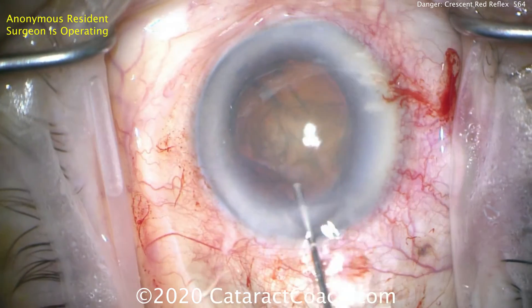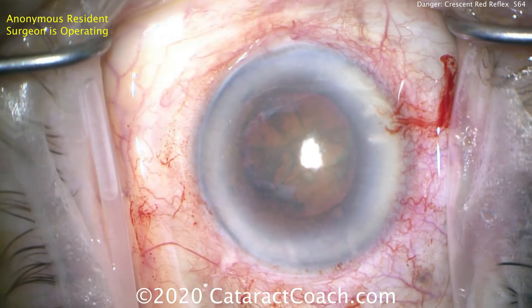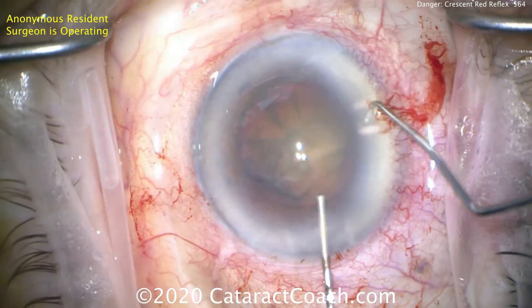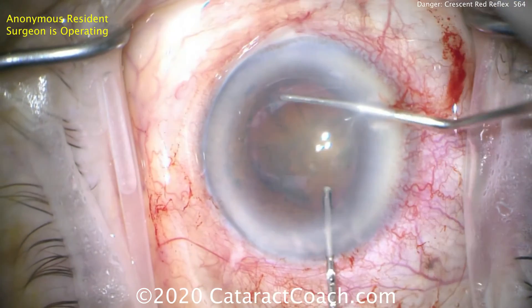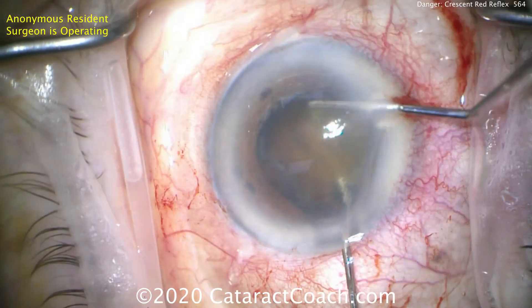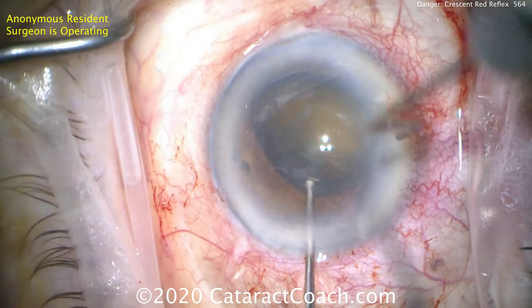Here's where we're going to be surprised. A little hydrodissection — let's try to get the nucleus out of the bag. By getting the nucleus out of the bag, we'll hopefully put less stress on it. Let's see if we can save this capsulorhexis bag. So we try to lift the nucleus a little bit and look what we see. Gently lifting that up — watch. There's that red reflex. That little flash is all you're going to get.